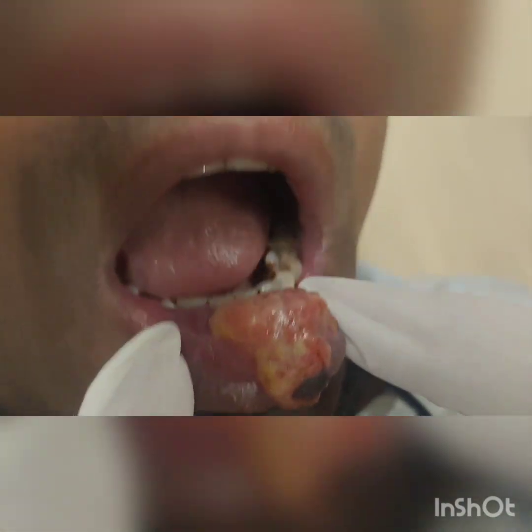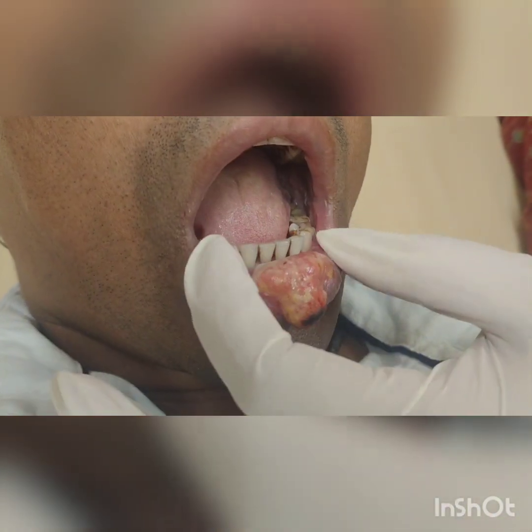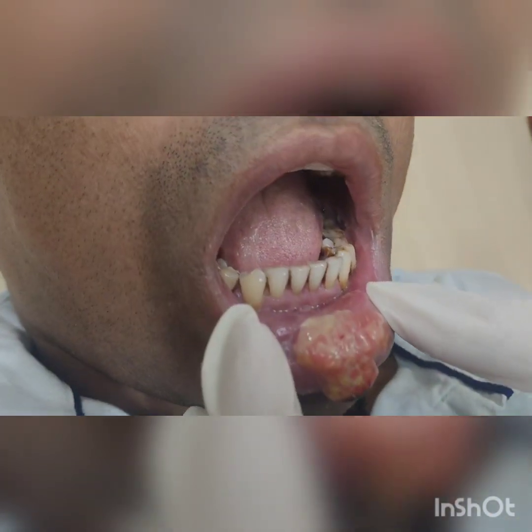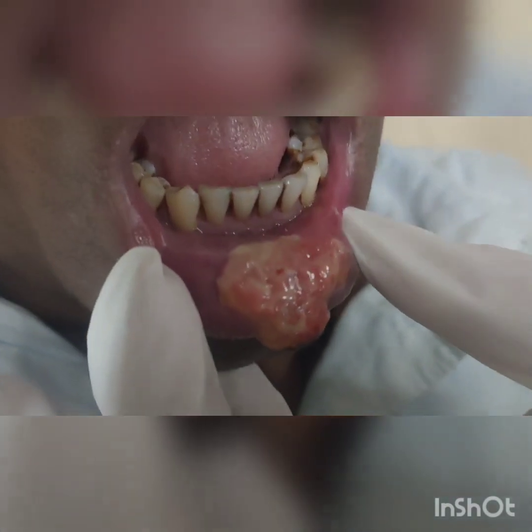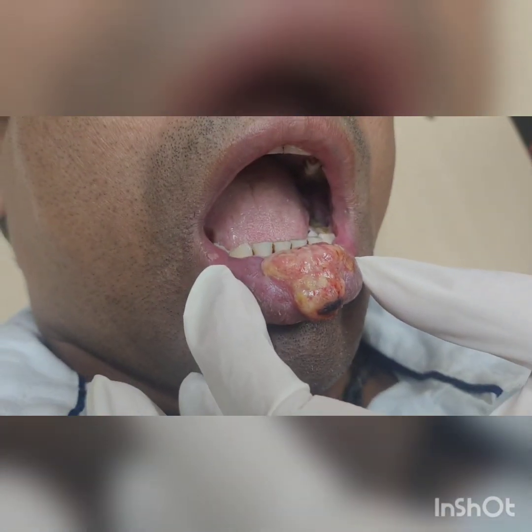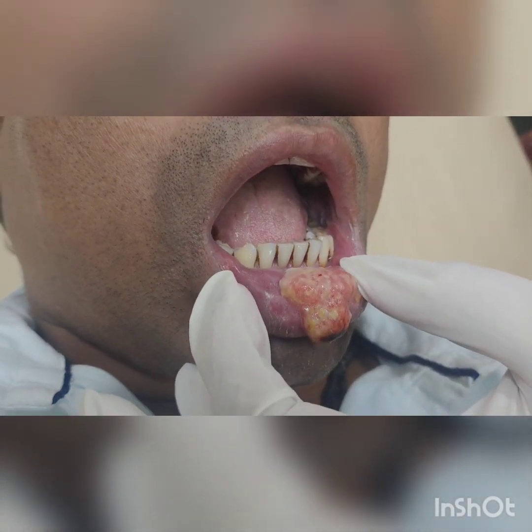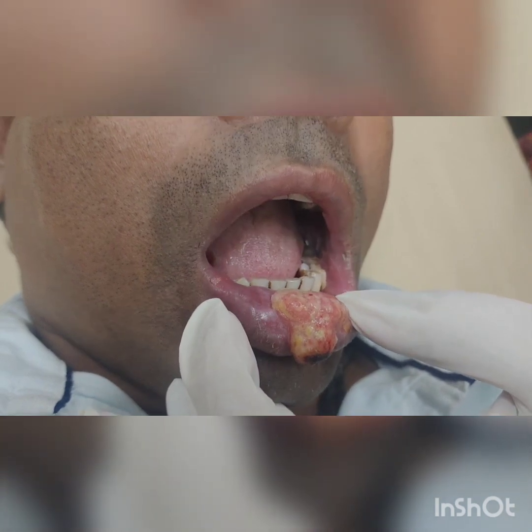Good morning. This is a case of CA lower lip, confined to the lower lip. There is no GBS involvement and there are no nodes, so we are going to plan for the mold brachytherapy — a very simple way to make brachytherapy with the help of a small piece of thermoplastic mask, wax, and wires. I am going to demonstrate.